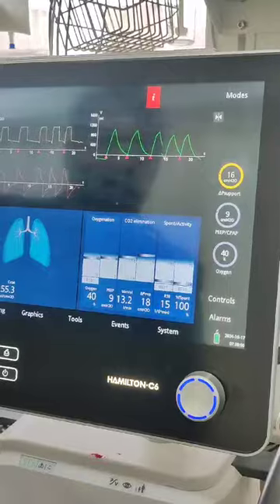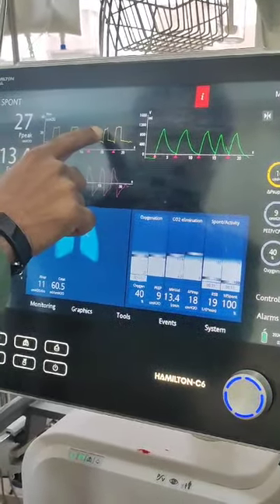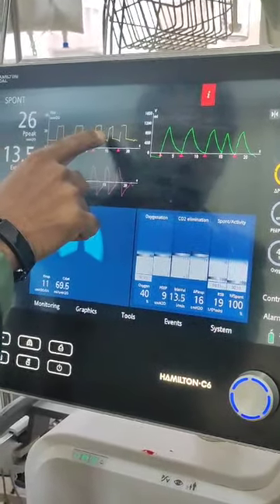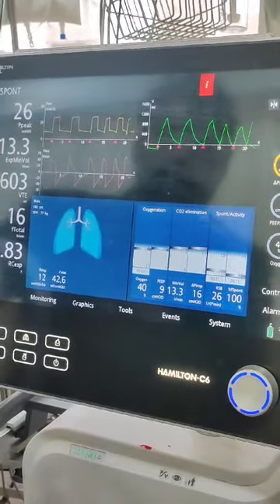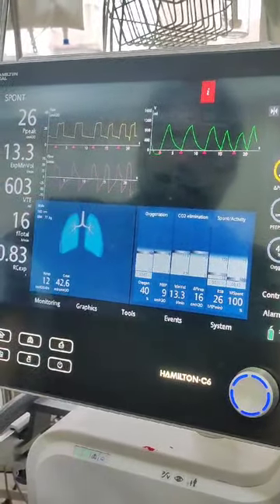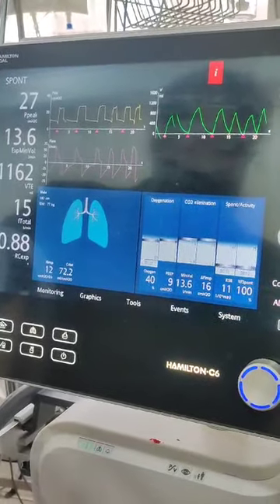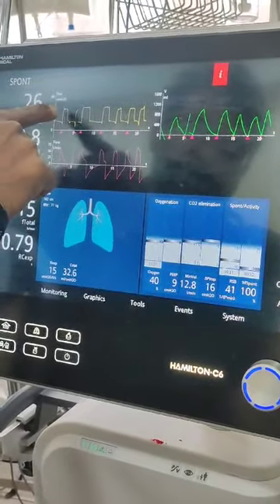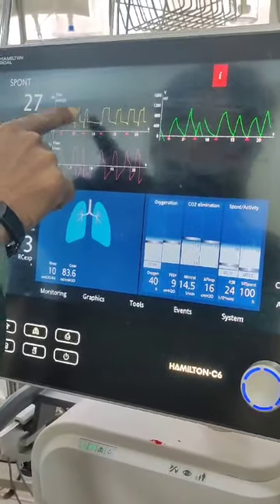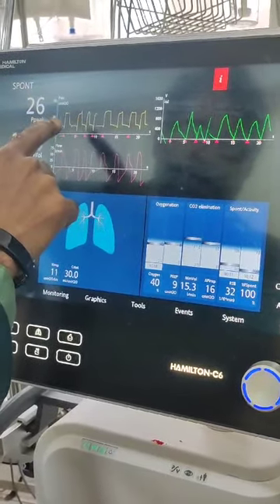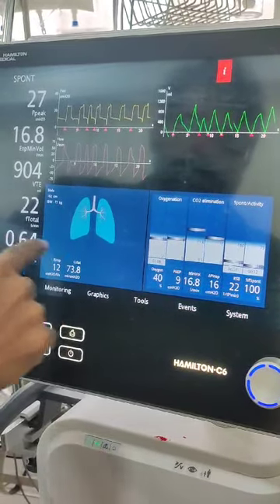I'm going to 16 now. At 16, the trace is slightly changed — there's a slight change, but it remains essentially the same. The assistance has remained. So it does look like 16 of pressure support is needed. At 16, there seem to be at least alternate breaths going okay, but it still looks like he requires some additional support. He's awake now.